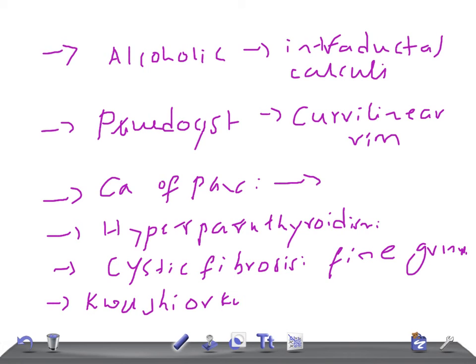Cyst adenoma or cyst adenocarcinoma can also give rise to pancreatic calcification. They can produce a sunburst appearance, though it is not specific. Idiopathy can also be one of the causes for pancreatic calcification. These are the important causes to know.